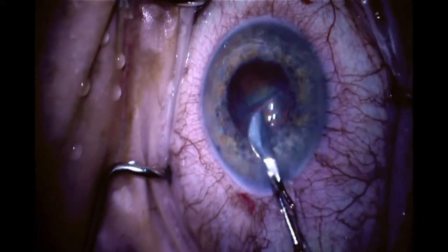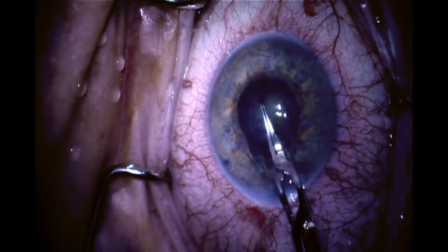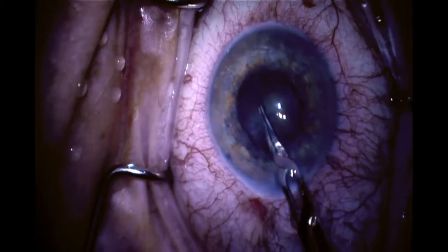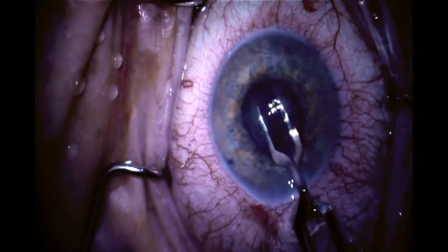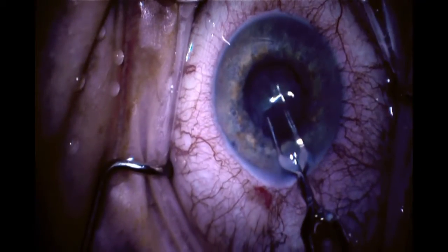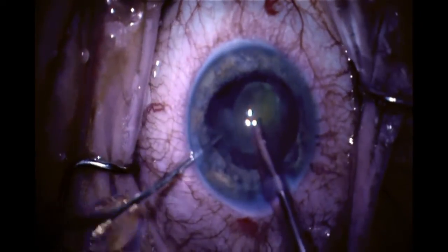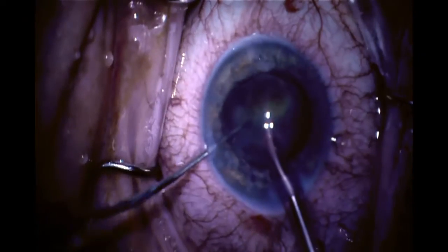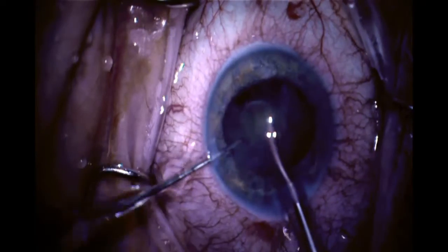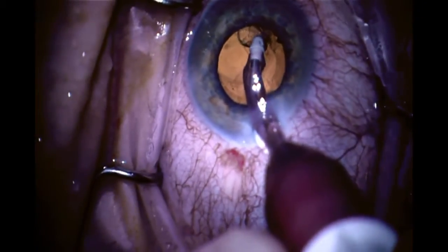Today I want to show you a video of a combined cataract extraction and ab-interno-canaloplasty, sometimes also called ab-interno-viscocanalostomy. This is a patient with granulomatosis with polyangiitis who had a visually significant cataract and medically uncontrolled glaucoma. In his fellow eye, he had undergone retinal detachment repair given his high myopia and a tube shunt implantation, which was complicated by recurrent erosions. As such, we decided to try an ab-interno canal-based procedure prior to going forward with more traditional filtering surgery.